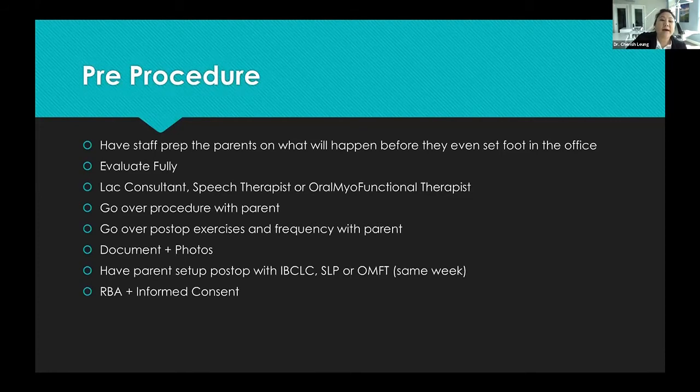Different story. So you want to go over the procedure with the parent in full. I also demonstrate the post-op exercises like I told you before, because that's going to be the most difficult for them, and they have to do it all alone at home. You're not there to hold their hand, so it helps for you to actually demonstrate it for them. You can do it right after the procedure, but usually babies are crying, so you might not want to do that, or you can just do it before while you're doing the exam, and that's really sufficient as well.